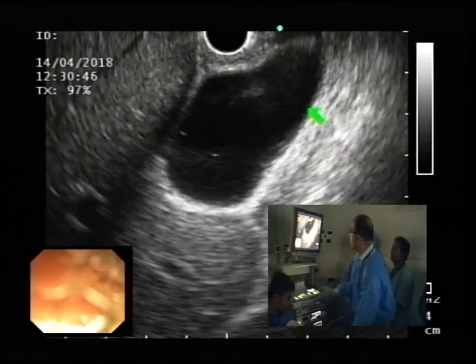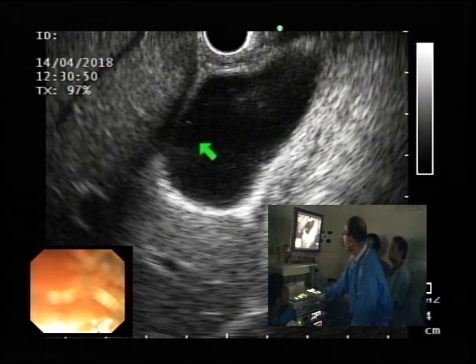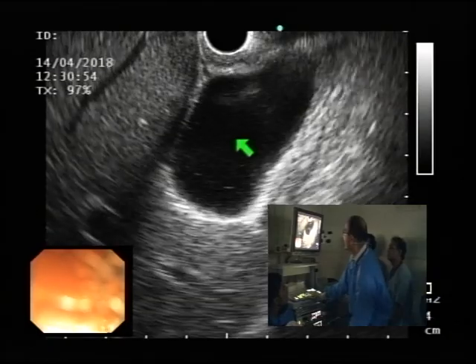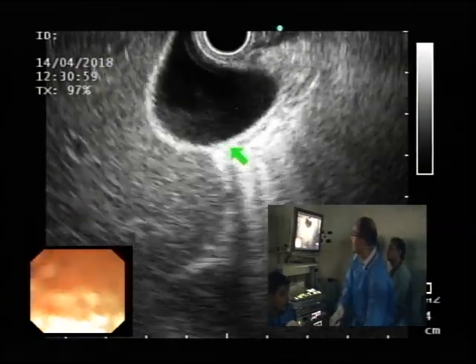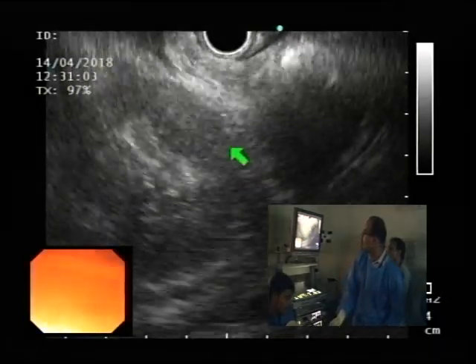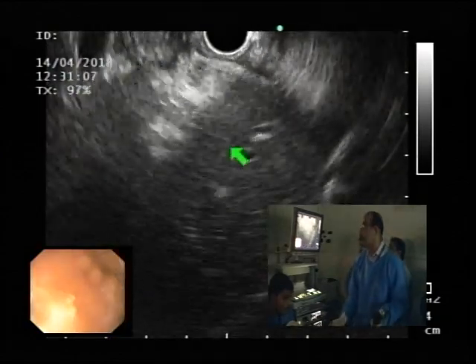Yes. The other thing is, if you look at the gallbladder, there's floating debris in it. So this is real. See that. Yep. There's real debris in this gallbladder, which may not be picked up with any other modality. So as I give some forward pressure and go clockwise, not always, but most of the time you can get your bile duct portal view.